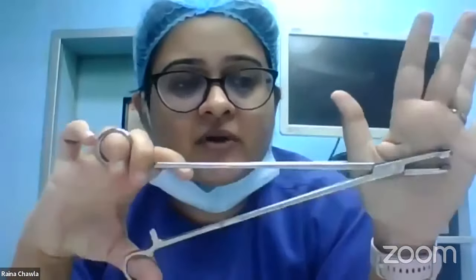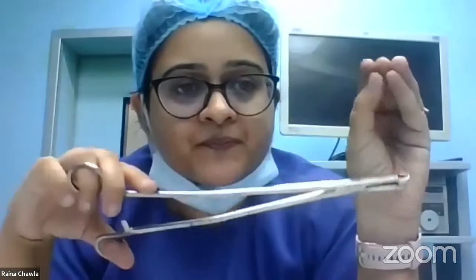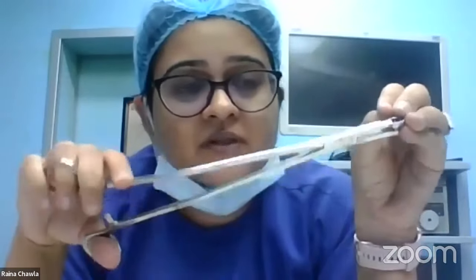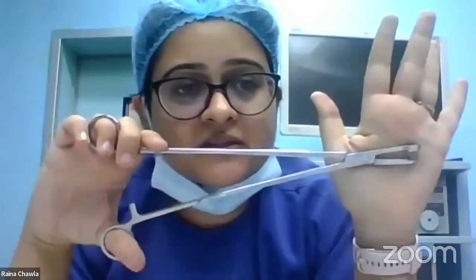This is a punch biopsy forceps. And one important thing which they ask in the exams is, where will you take the biopsy from? Say there's a growth, a 2 centimeter growth. Will you take it from the periphery of the growth or the center of the growth? From the periphery. Yes, okay. Because in the center area, you may find just necrosed tissue, and the pathologist may not be able to give you a proper diagnosis. What we are worried about is we should not be missing malignancy. So if you take tissue from the periphery, you will get better tissue.